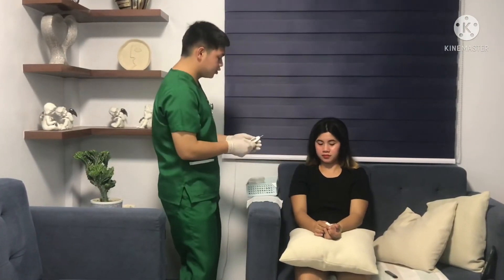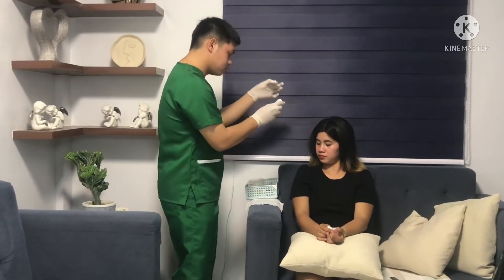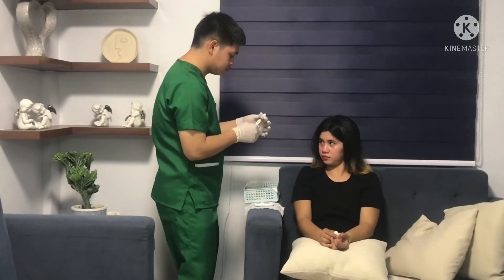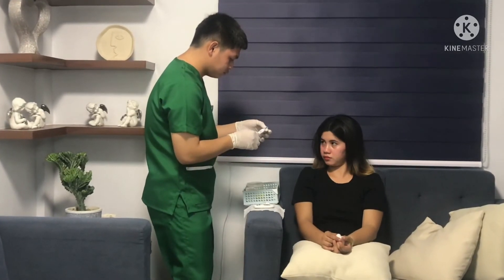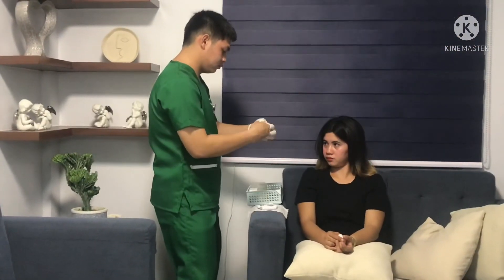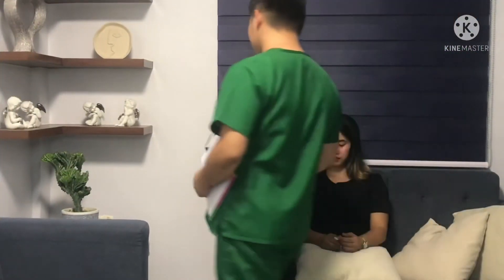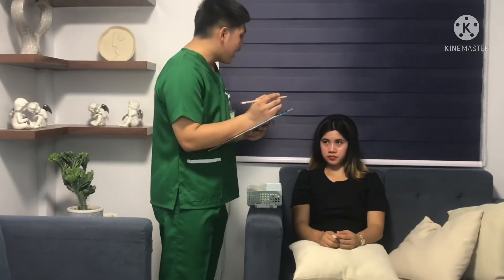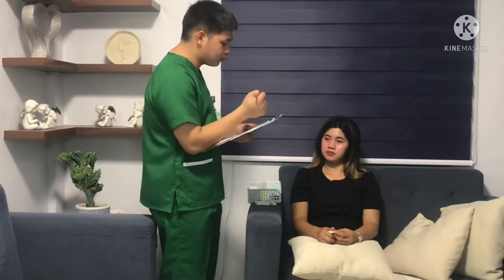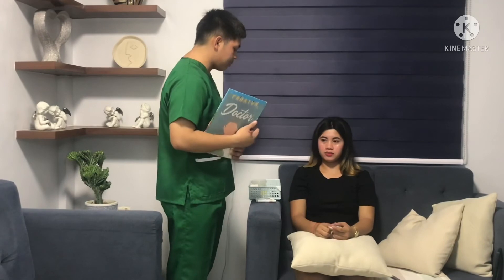Read the results on the unit display. Turn off the meter and dispose of the test strip, cotton balls, and the lancet according to agency policy. Use caution with the lancet to prevent an unintentional sharps injury. Remove your gloves and once again perform hand hygiene. Document the results and related assessment findings. Report critical values according to agency policy, such as values below 70 or greater than 300, and any associated symptoms.